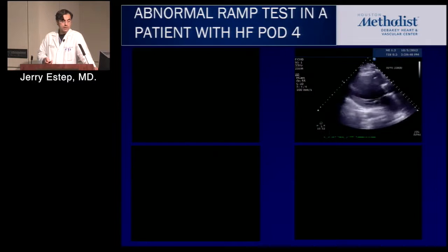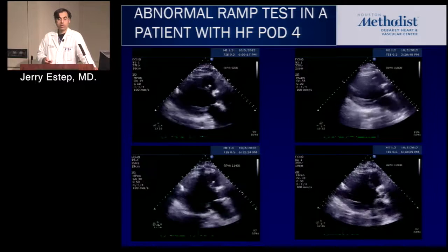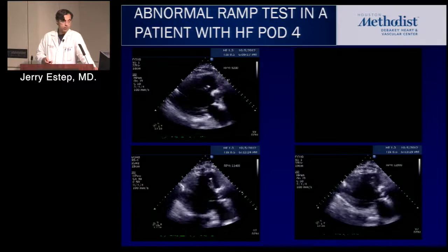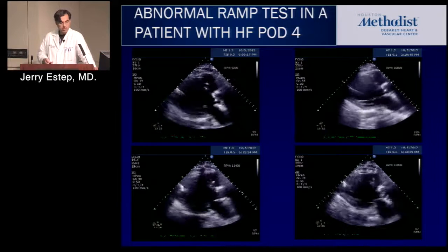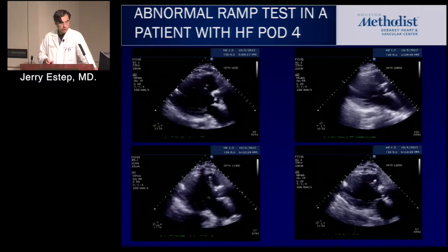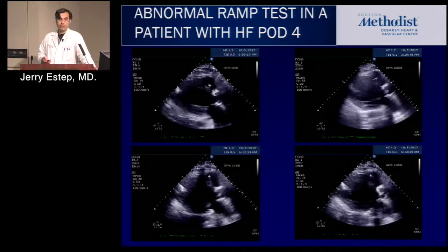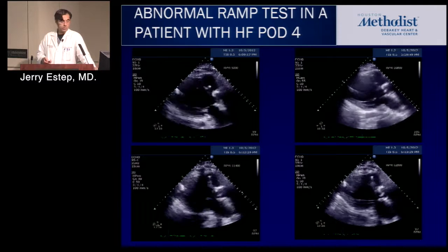So we've modified it, and I say this so the techs know that we're trying to minimize their work. You go to Columbia, you're doing 12 speed settings. We just want low and high, and we compare the two to understand if the pump's working or not. So this is another example, post-op day 4, some ingestion, I think, of probably clot and subsequent rotor thrombus and outflow cannula obstruction, to where even if the images aren't the best, you can appreciate LV size, aortic valve opening, nothing's changing. We crank that pump up to 12,000. So something's wrong with the pump.